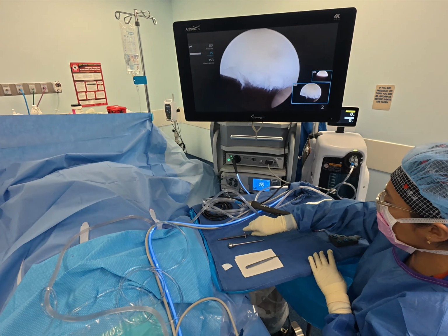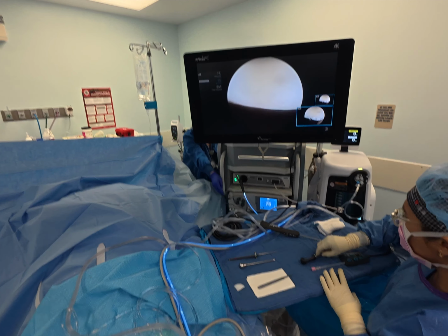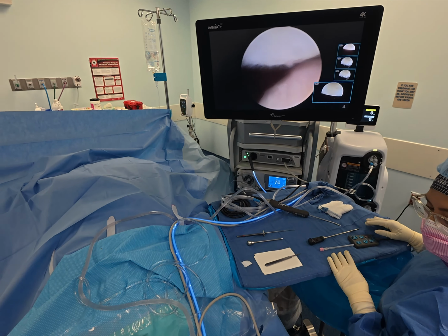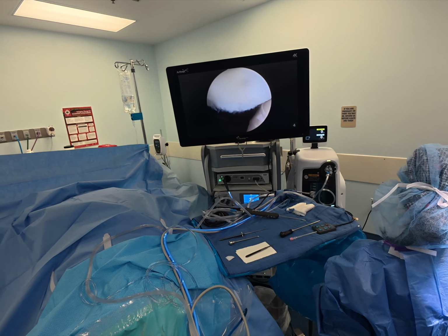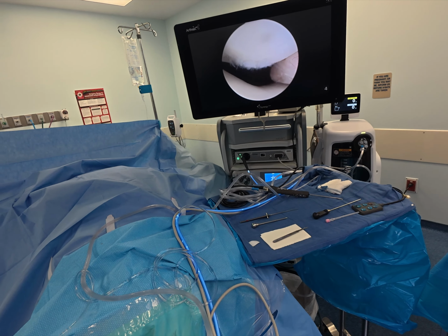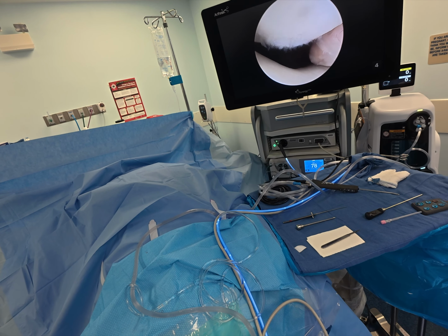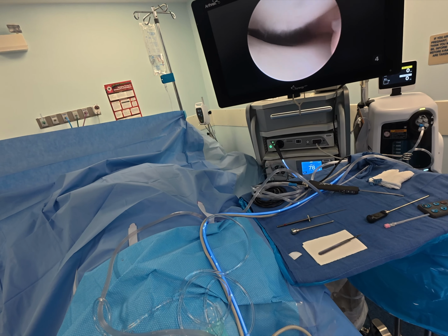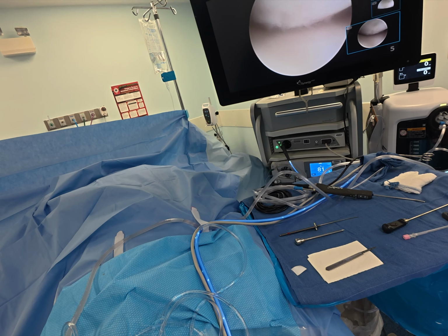Compare and contrast this, what we call chondromalacia patellae, to this normal, smooth, soft articular cartilage. So here's the diseased cartilage that I pointed out on that MRI, and you can see that it's arthritic. As that kneecap articulates, patient will experience pain and discomfort in the front of the knee because of that irritated cartilage right there.